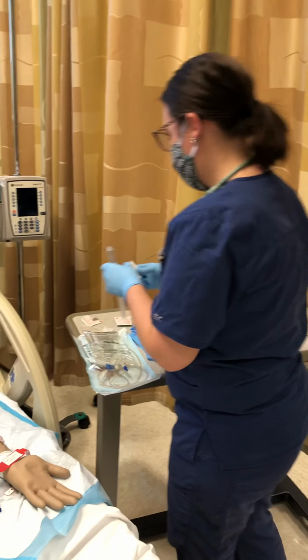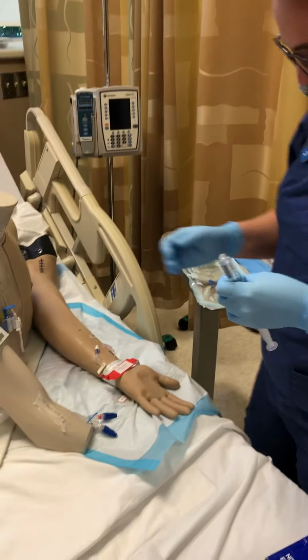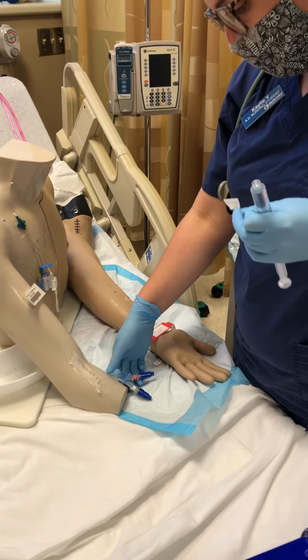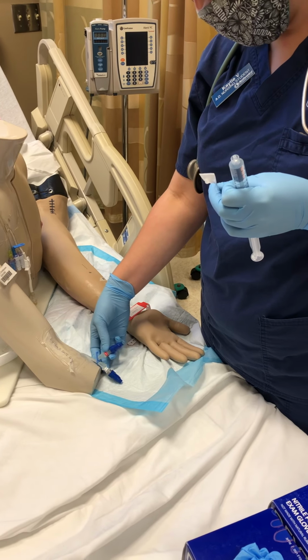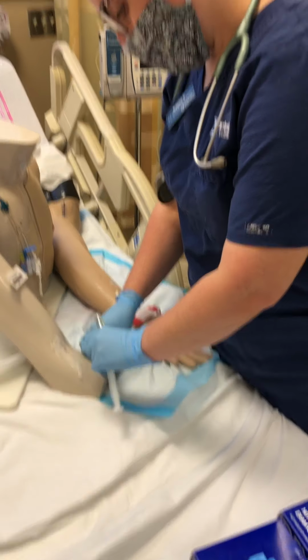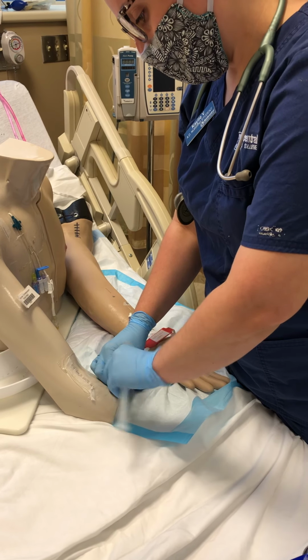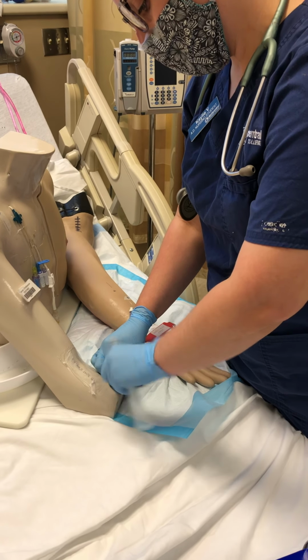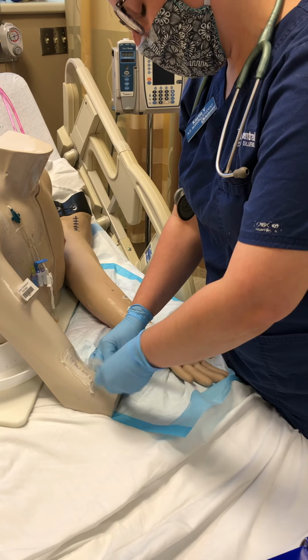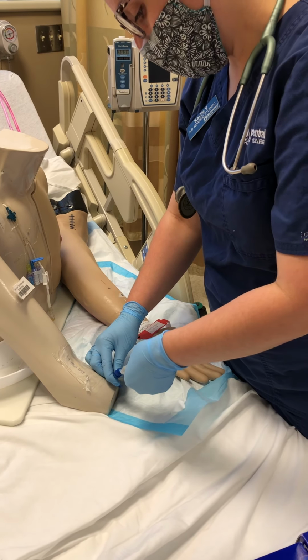Says for this amount, it could be pushed in over 1 to 2 minutes. So people look at the clock. I checked the chart before I came in, and we're using this red line for blood and the white for medications. So I'm cleaning this line. Nice and clean.